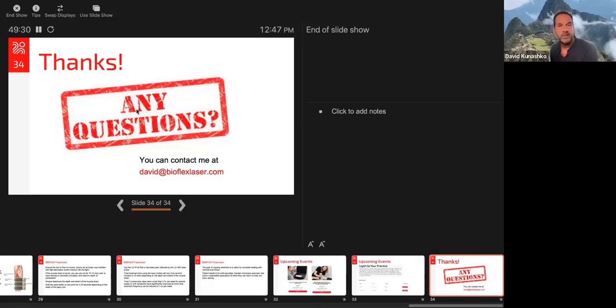I wanted to ask about some clinicians that use cling wrap over the head of a laser diode. Can we use that because of COVID? I'm not sure I understand that question, Rashimi. I don't know why you'd use transparent wrap over the head. We use transparent wrap over an open wound, for any infection, that kind of thing. I'm not sure how that relates to COVID, however.